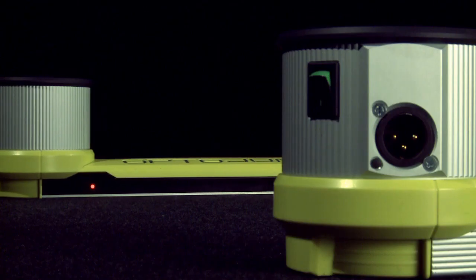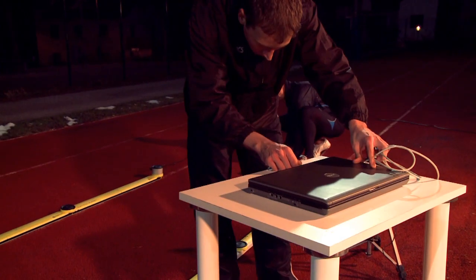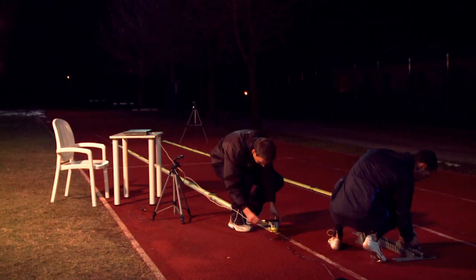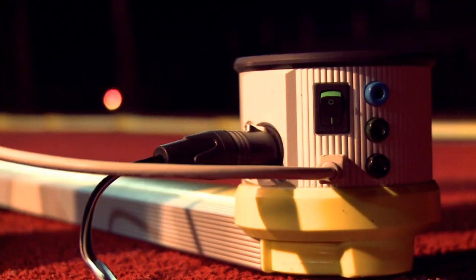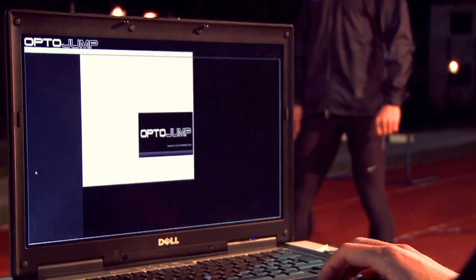When the green LED signals the positioning is correct, connect the receiving part to the computer using a USB cable. MicroGate has developed a special software to manage the entire system, divided into three sections: Master Data, Tests, and Results.